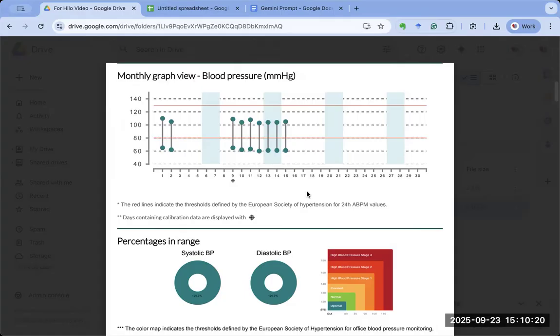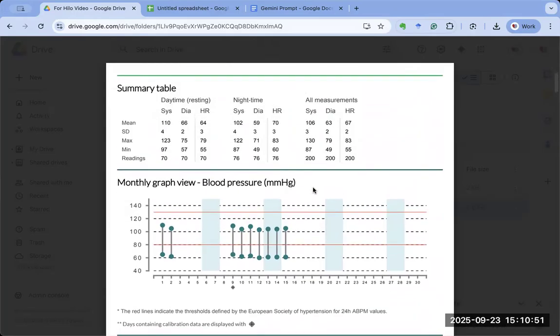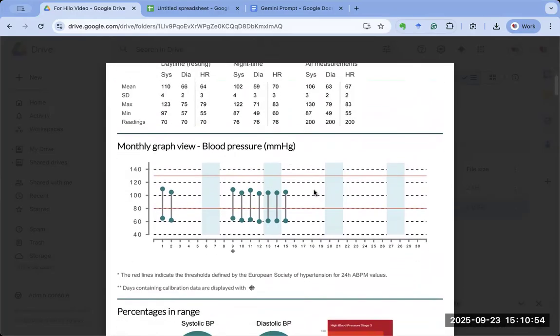You need to talk to your doctor about what your target levels should be if you have kidney disease, if you have heart disease, if you are on multiple medications, if you have diabetes. This is not medical advice, but for many of you who are going to watch this video, I have talked to you about the stricter numbers that you need, because of your younger age, or because you do not have a whole lot of diseases going on. So it is important to know what your specific target should be.